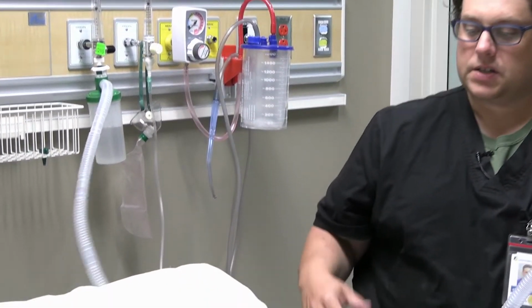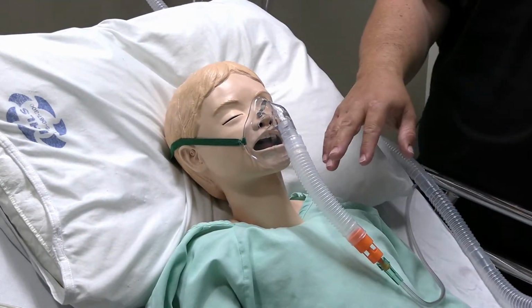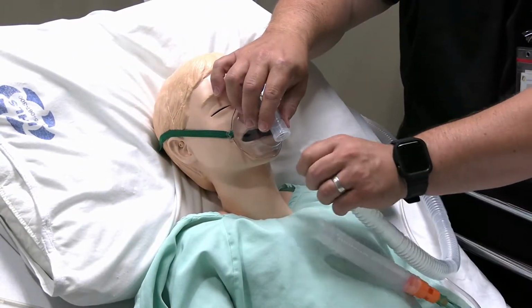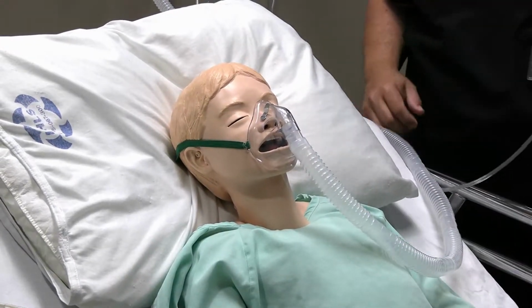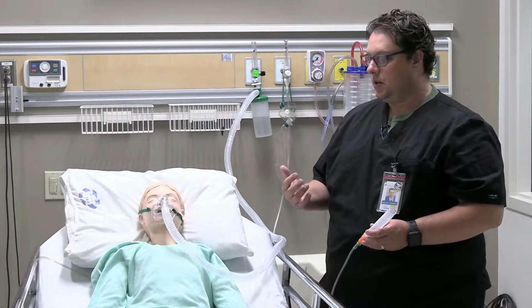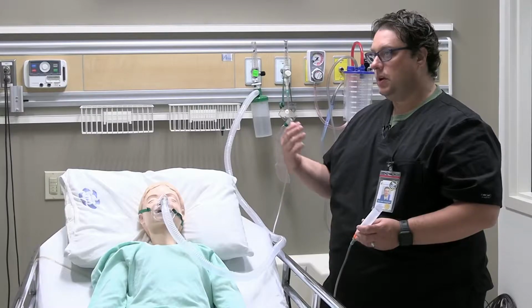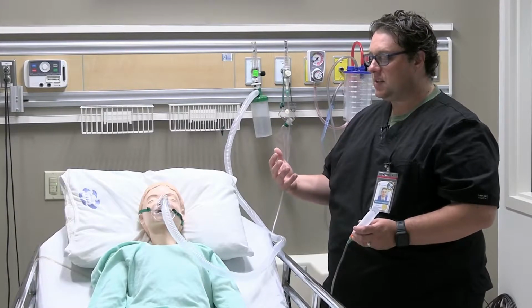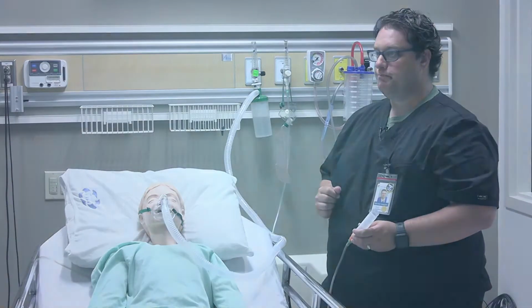Perfect. All right, so since the patient already has an aerosol mask on, I can just quickly remove the corrugated tubing from the Venti-Mask and attach the aerosol tubing to the patient. Okay, and then you would go through your reassessment to make sure that your patient is comfortable on this. And also too, given the current vitals where they are, you could probably even consider weaning your FiO2 at this point as well.